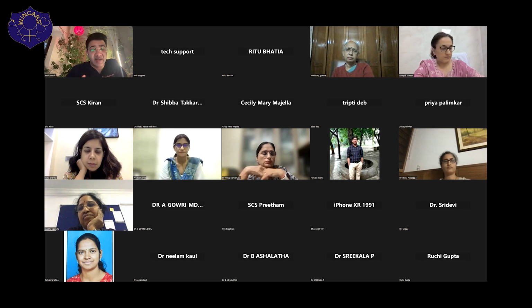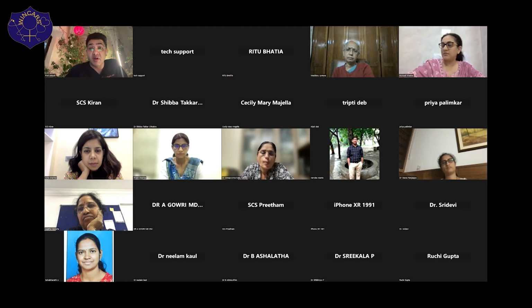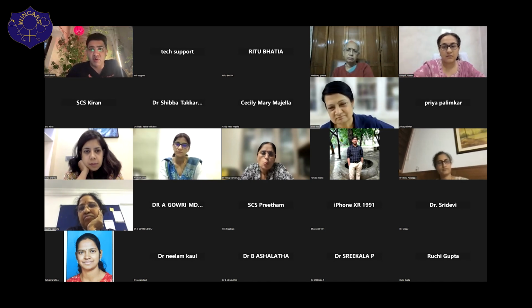So as rightly said by Dr. Richa, it's very important to identify the cause of ISR, number one. And number two, we have realized that debulking is very important in these cases. In our lab, we are doing one trial with the use of 25% contrast for lasing these patients. We do believe that using debulking therapy, either in the form of rotablation or with the laser, may improve the outcome.